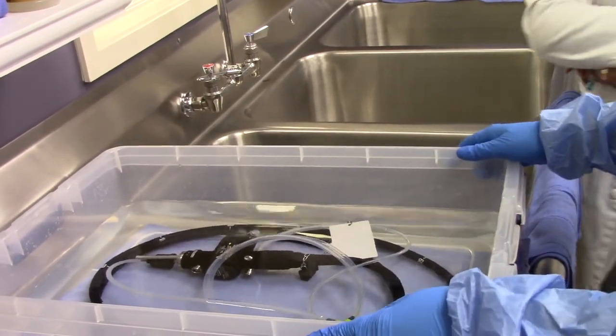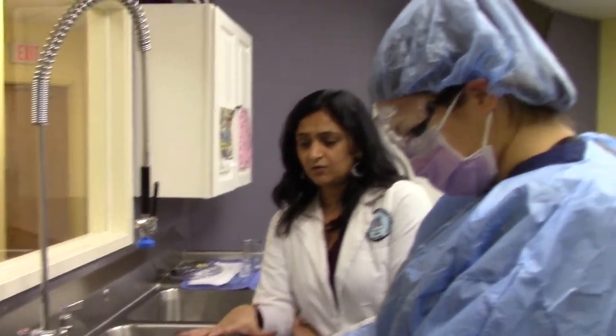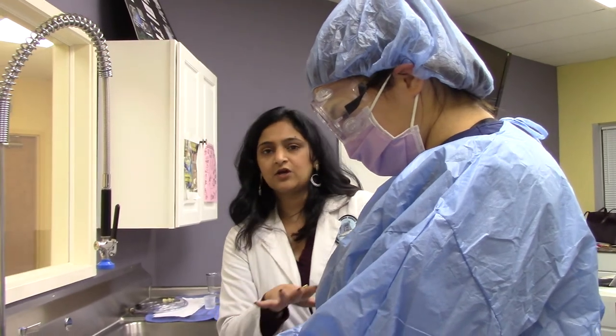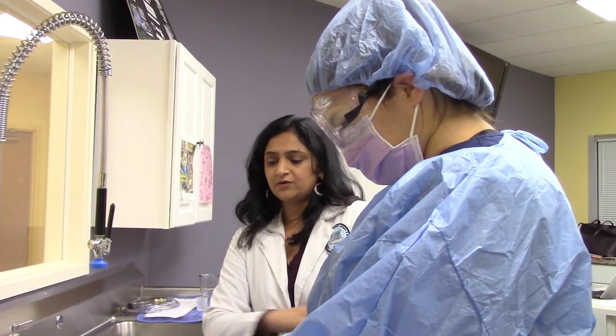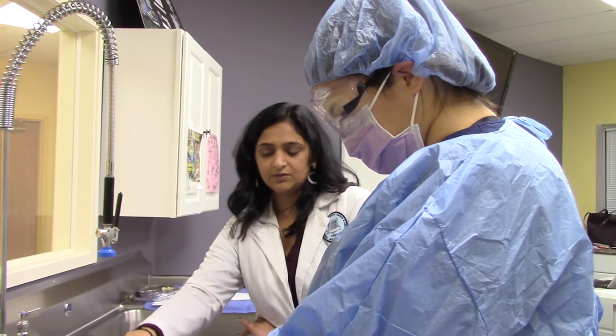Now for a certain specific amount of time, we have to leave the scope inside like this with the cover on top of it. For that instruction, we're going to follow the manufacturer's guide — whatever they say, that amount of time we have to put the lid on top of the bin.